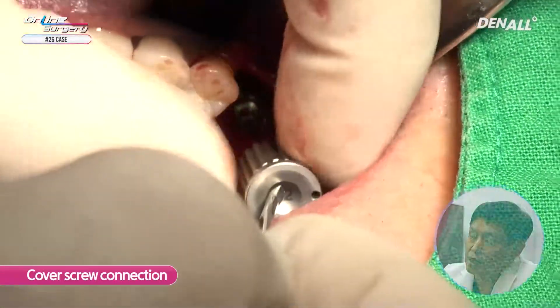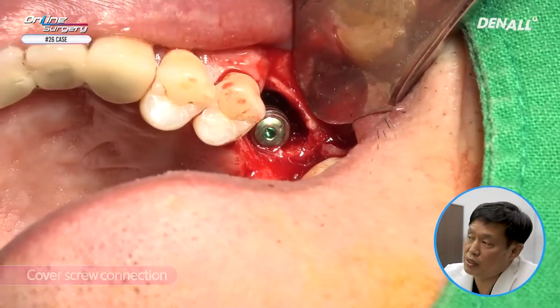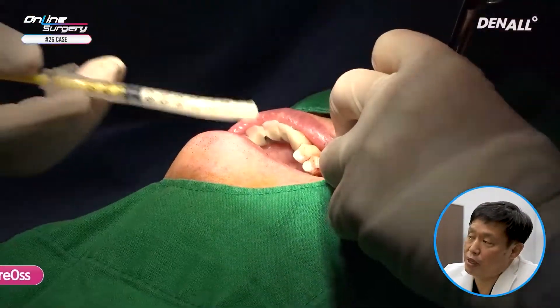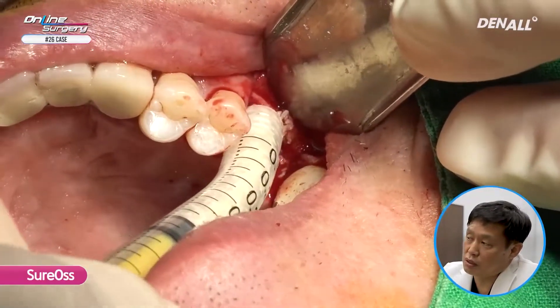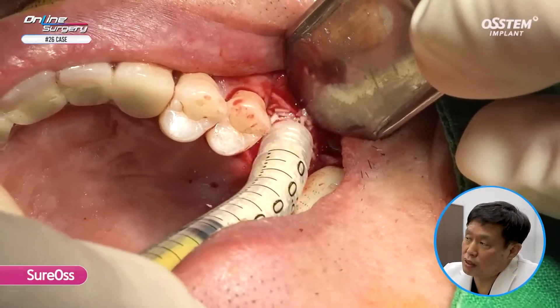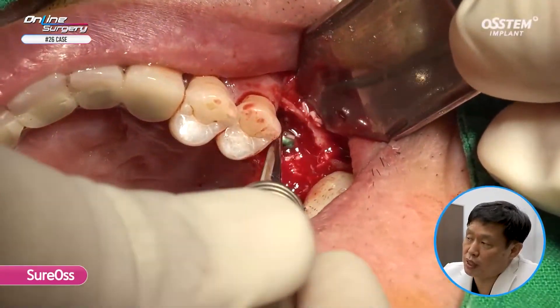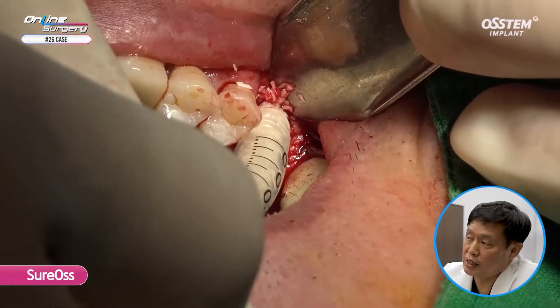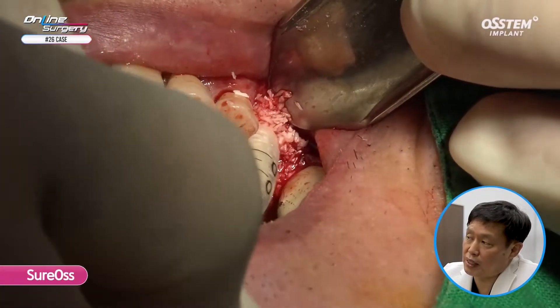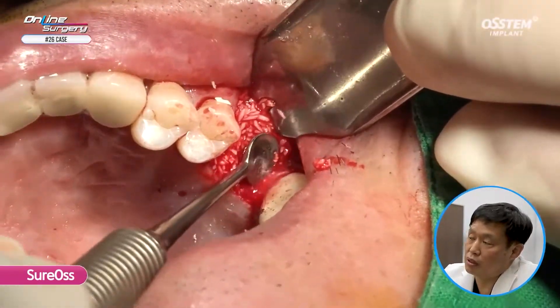After that, I close the surgery. As you can see, the buccal plate is intact. In the gap area, I used an allograft called Sure-Os, which is a chip bone to fill the gap. Between the implant and the buccal plate there is a gap of approximately 2 to 3 mm — chip bone is being packed.